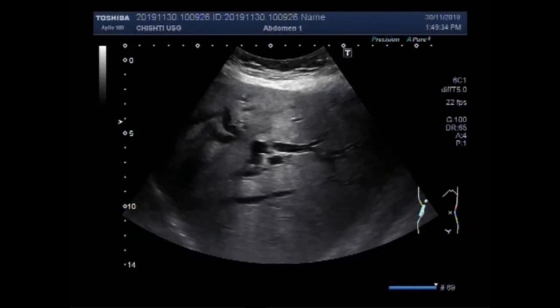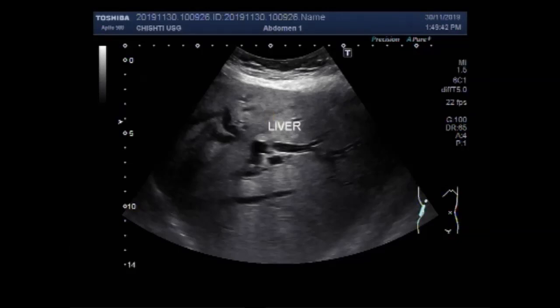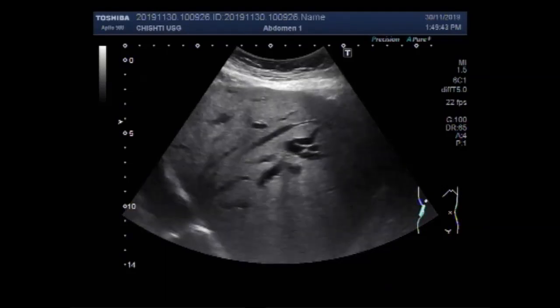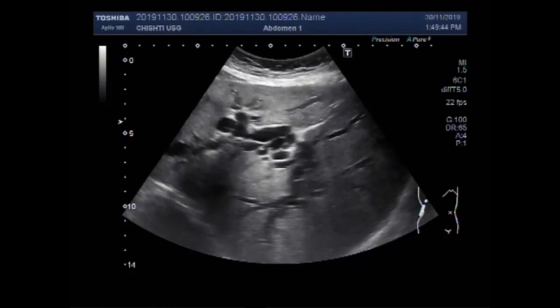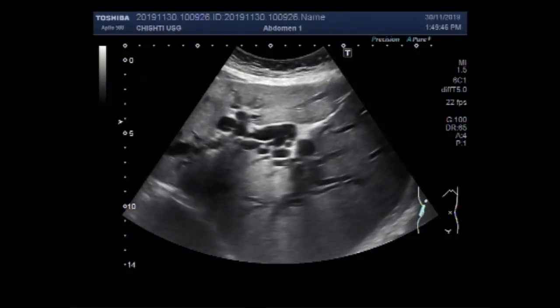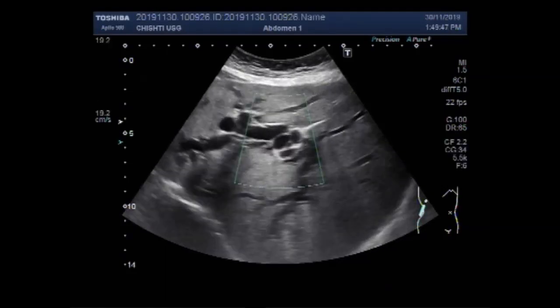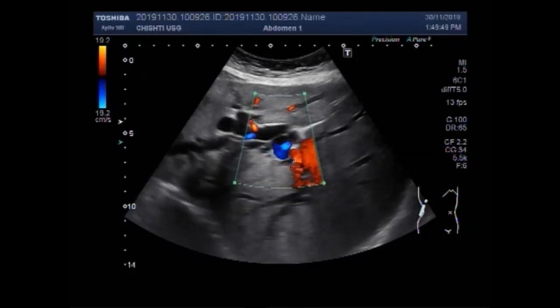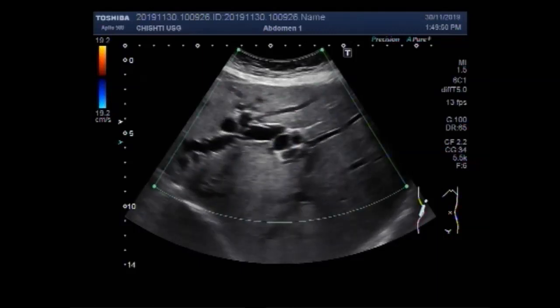Dear viewers, I hope you are all fine. This ultrasound video shows grossly dilated biliary channels. You can see the liver and all the intrahepatic biliary channels are dilated.